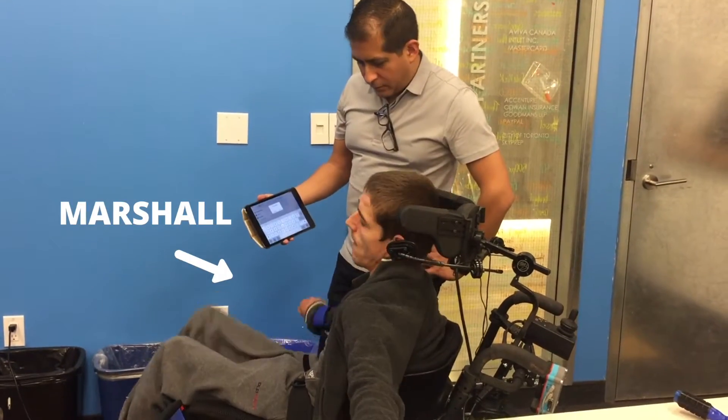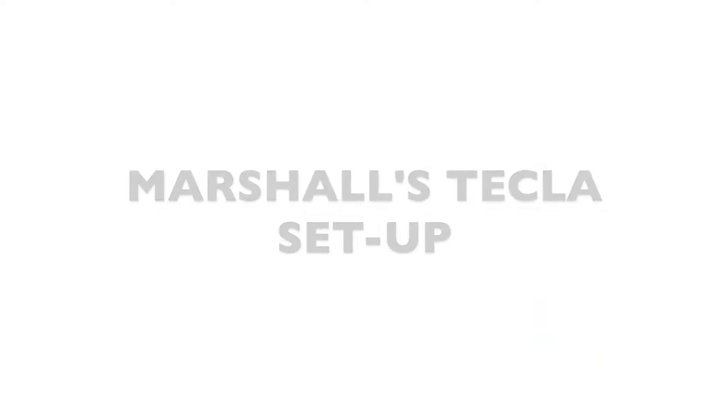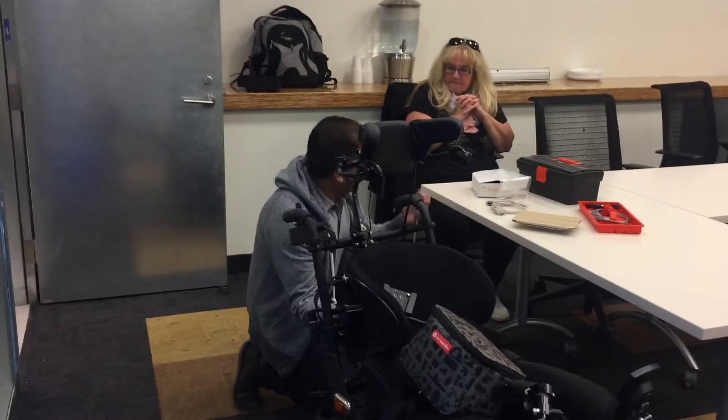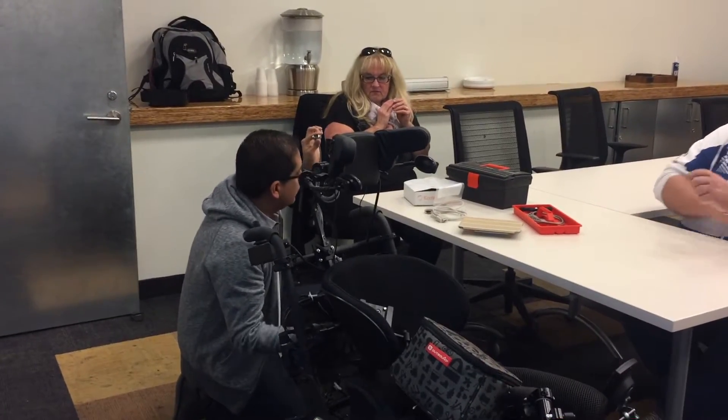Marshall came to visit us to get his Tekla set up with his wheelchair. To set up Marshall's Tekla Shield in his new powered wheelchair, we used a splitter cable, his Tekla Shield, and an input-output module. Marshall's powered wheelchair output has four commands: forward, backwards, right, and left.